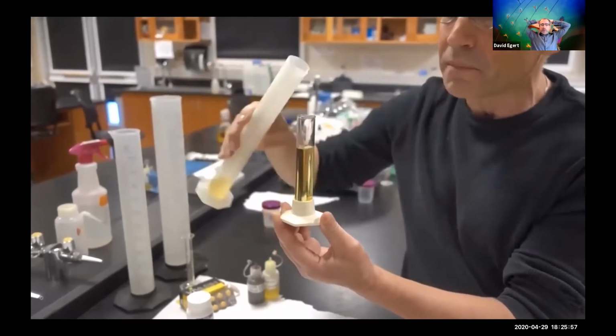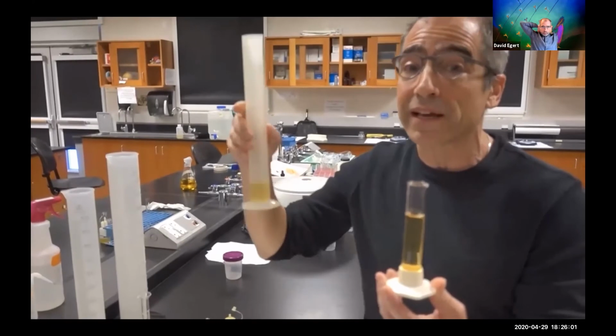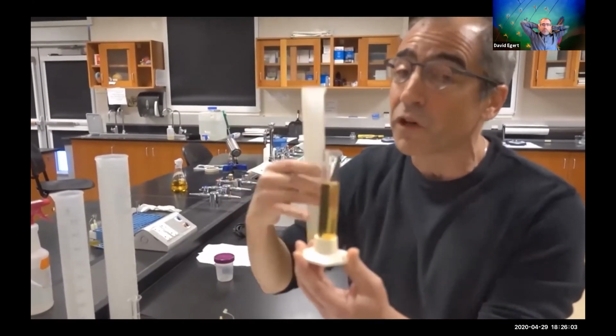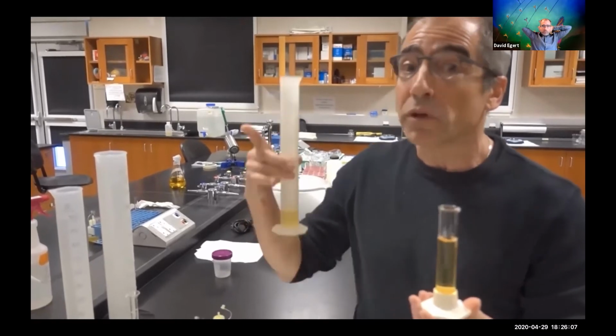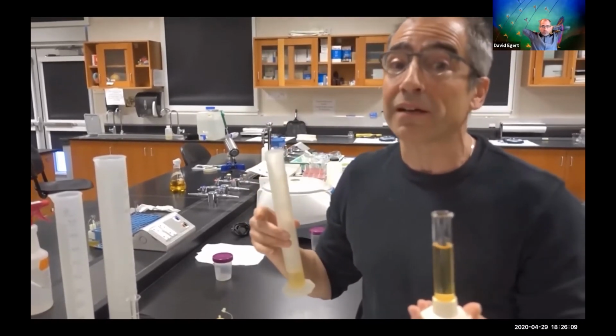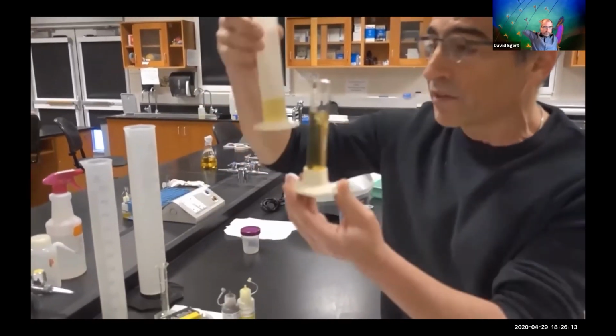So typically you add about maybe 2/3 of the height of the tube. If you did not pee at all, you're not going to be able to get a value. And again, if you didn't get enough urine to actually float the float, you just have no reading for specific gravity. It wouldn't be 0. 0 is not valid, it would just be null. You don't have a value. But I have enough urine.